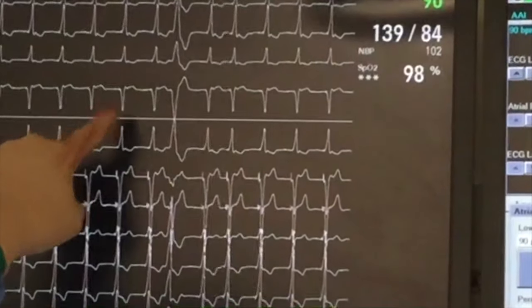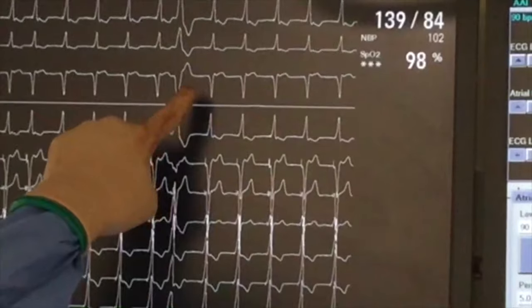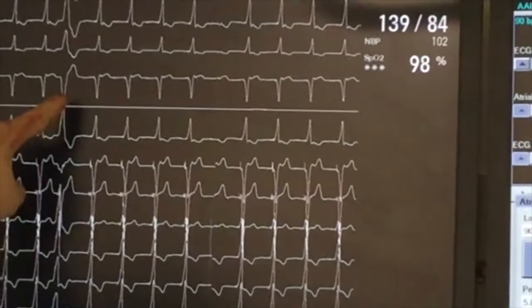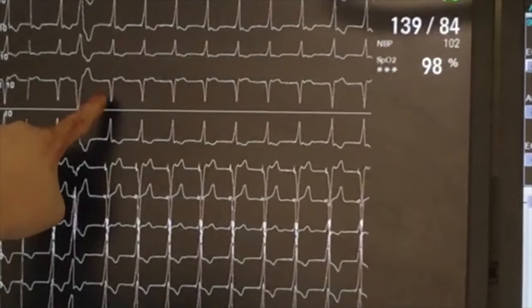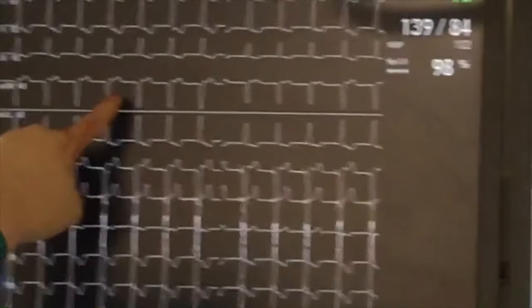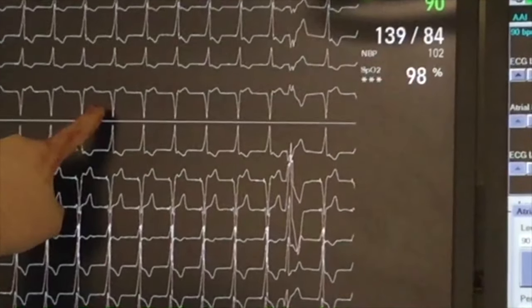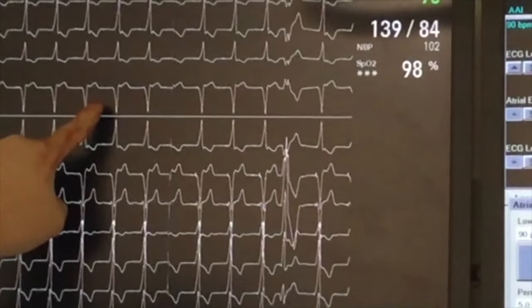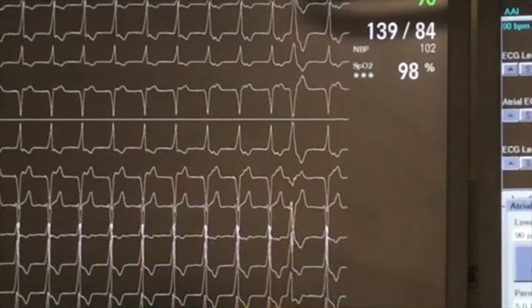With his-bundle recruitment at higher outputs, the local stimulus to atrial electrogram on the atrial channel can be measured. In this case, the interval is shorter at higher output. As the output is reduced to 1 volt at 1 millisecond, the local stimulus to atrial electrogram shoots out, and simultaneously, the QRS widens on the surface ECG. This clearly confirms his-bundle recruitment in this case. Based on our experience, we firmly believe that permanent his-bundle pacing can be performed safely and effectively in daily clinical practice. Thank you.